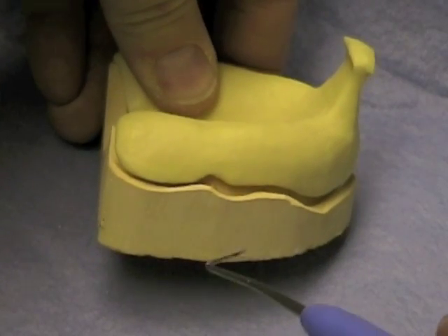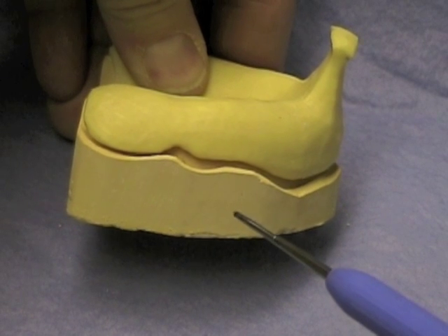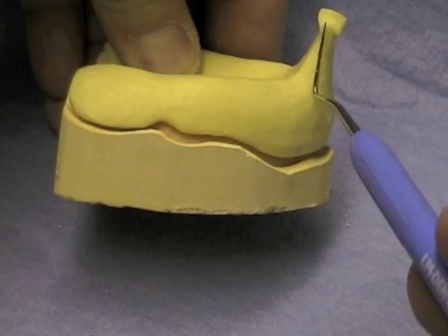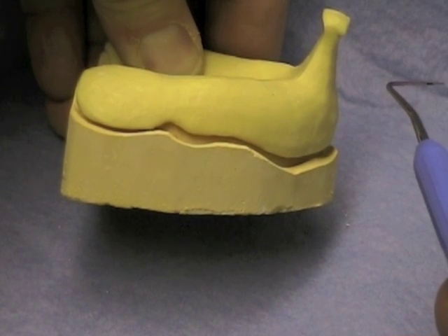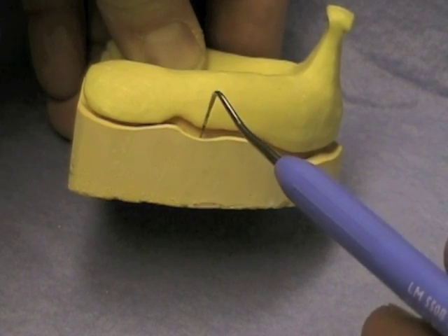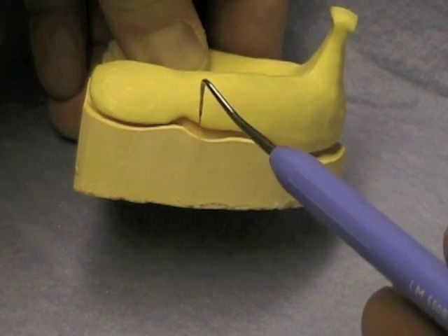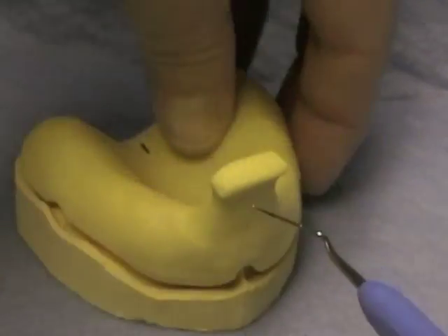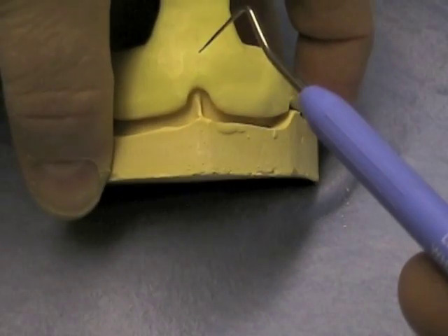Before you begin to make your impression, or even before you begin to border mold, make sure that your custom tray is properly made. Your handle should be relatively unobtrusive, oriented basically in line with the lips — it should not be pointing horizontally, as it will pull the lip out and distort the vestibule. Make sure that you have several millimeters of space between the depth of the vestibule and the edge of the tray, allowing room for the compound used to mold. Also ensure room for the frenal attachments, both in the buccal area and in the labial flange area.